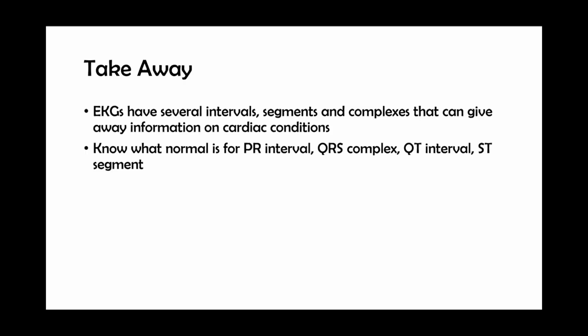Alright, good job. We went through a lot in this video. The takeaways for this video: EKGs have several intervals, segments, and complexes that can give away information on cardiac conditions. Keep in mind what a normal is for PR intervals, for QRS complexes, QT intervals, and ST segments.